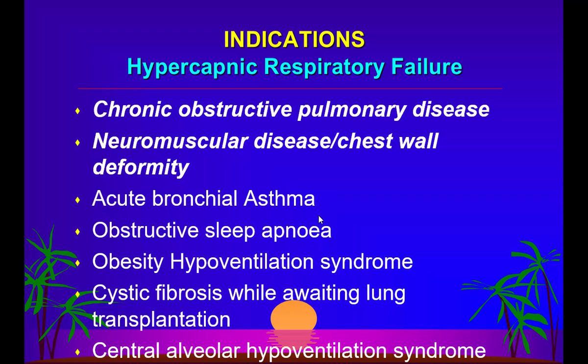You can try if a bronchial asthma patient is presenting with some sort of hypercapnia and some sort of respiratory failure. Then obesity hypoventilation syndrome is a definite indication.